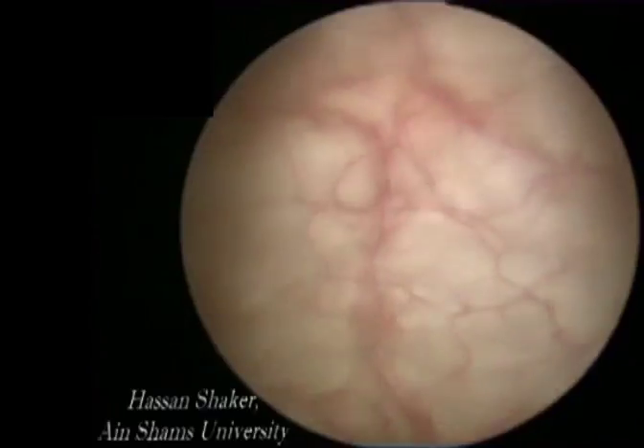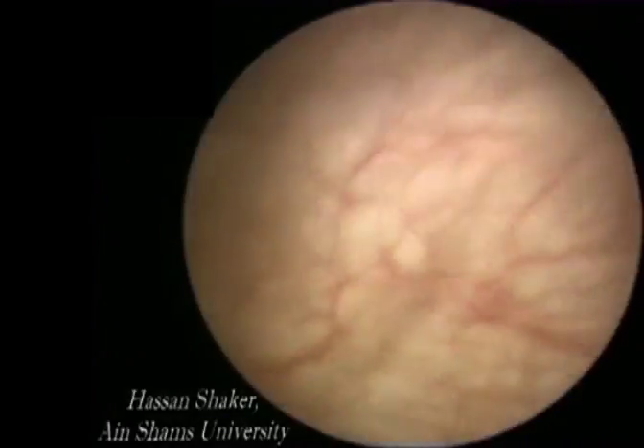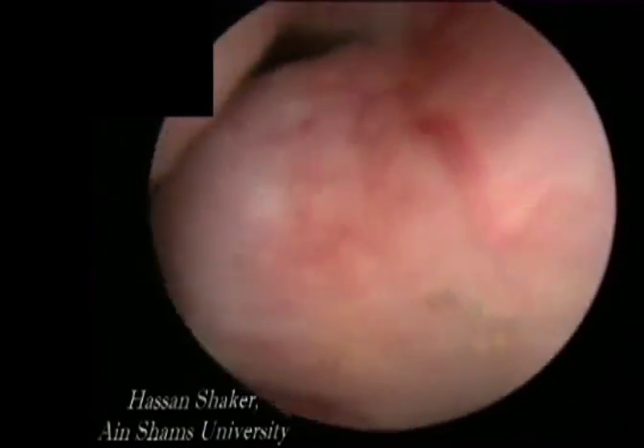In this video, we are demonstrating our technique in performing the Q-LAP in this 80 ml prostate. We developed this technique based on the Nesbitt technique of TURP.